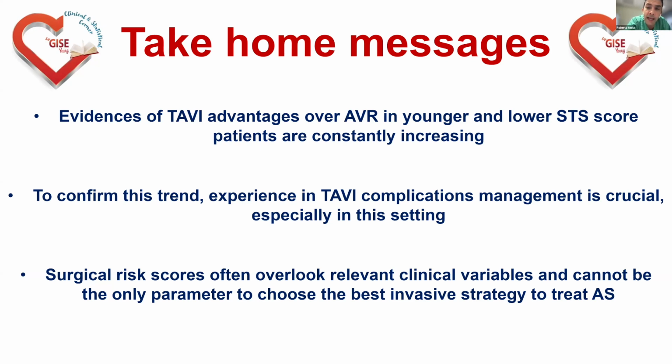But before that, I would like to ask you, well, in this patient, you have obviously a very nice anatomy, so you're not worried about vascular complication. But as I told you before, you should do whatever you believe is necessary to minimize your complications.